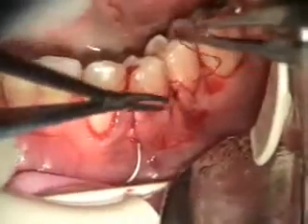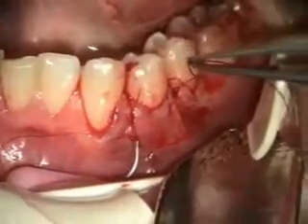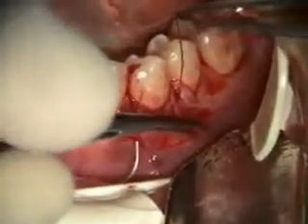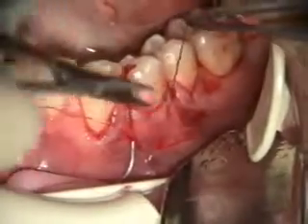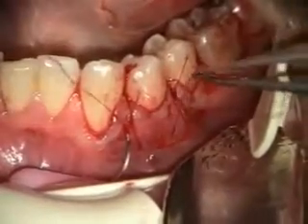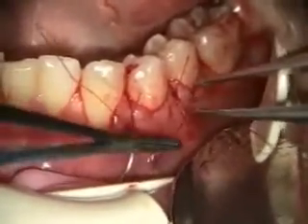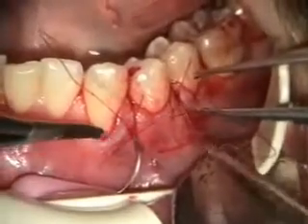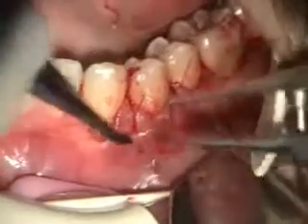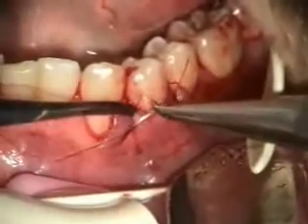I've done it both ways. One thing I find is that if I put the connective tissue side on the flap side, there's a little better — it kind of clots together better. Then again, I have no absolute proof that that's how it is.